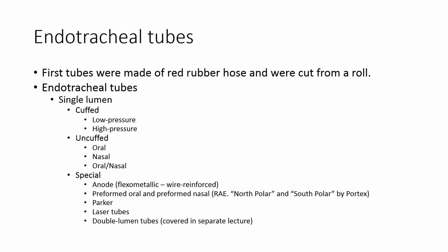There are preformed tubes which have other names such as North Polar and South Polar, made by Portex. There are Parker tubes, which are somehow or other designed for manipulation at the time of intubation. They're not a tube that I have any experience with. We do have them on order, though.